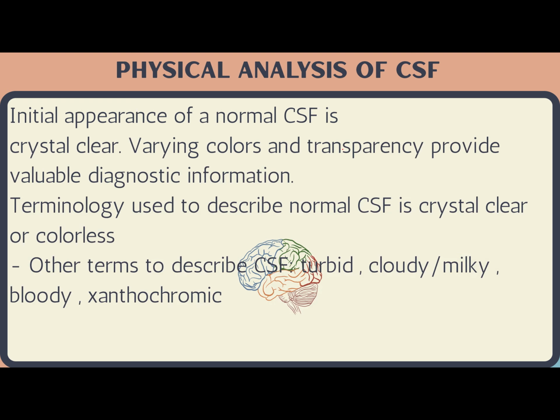Now, let's continue with the physical analysis of CSF. The initial appearance of normal CSF, class, is crystal clear, because remember, the blood-brain barrier is a very tight filter. It does not allow substances to easily pass through. So, most of the time, your CSF would appear crystal clear. Varying colors and transparency would provide diagnostic information. The terms used to describe normal CSF, class, are crystal clear or colorless.